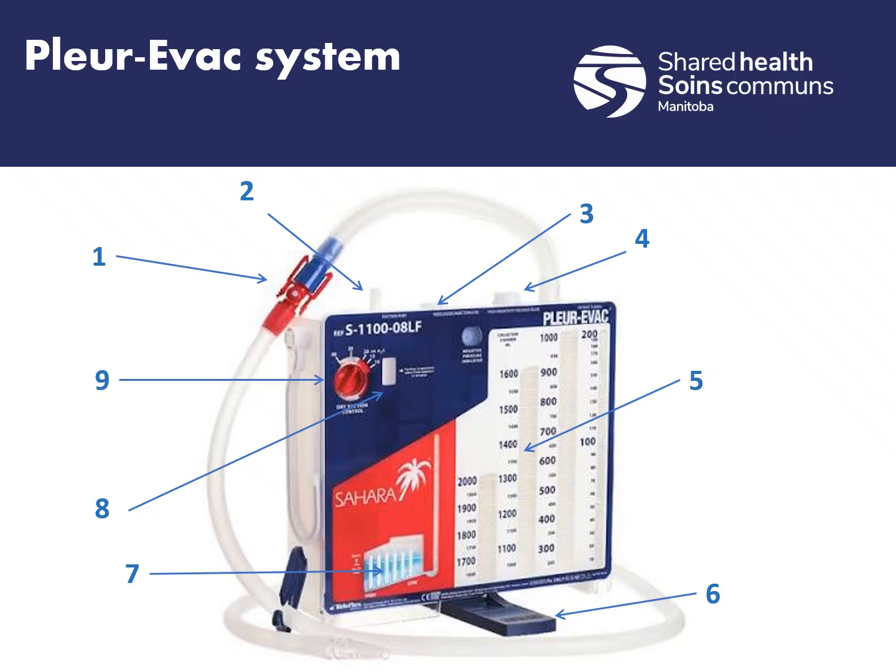And the next thing, next to that, is the dry suction control dial. This suction level is determined by the position of the edge of the red stripe. Basically we turn this dial. They're preset to -20 centimeters of water pressure, but it may need to be changed based on what's prescribed by the physician and the needs of the patient. So with this one here, we would control our negative suction that way.